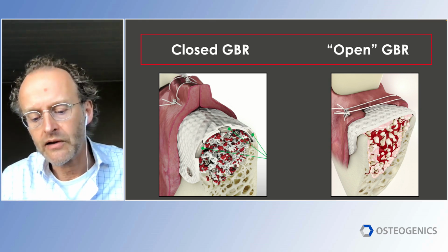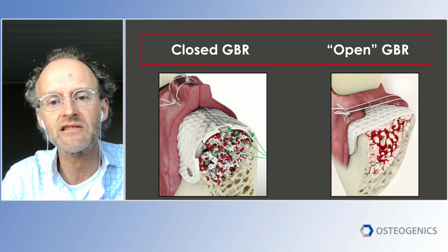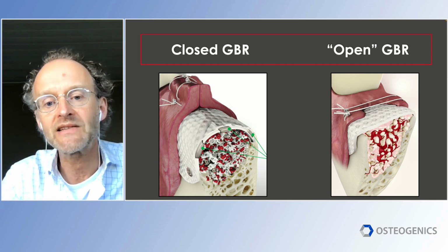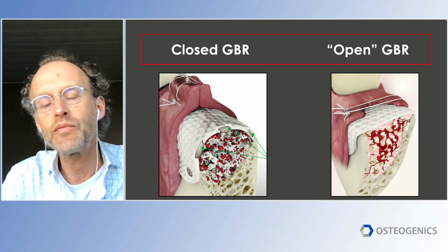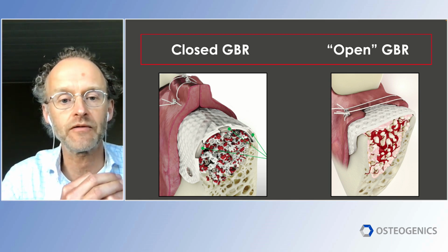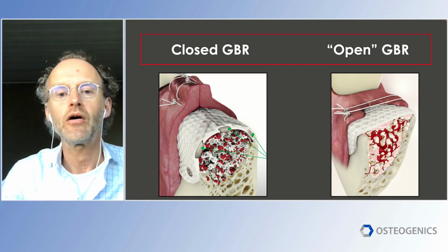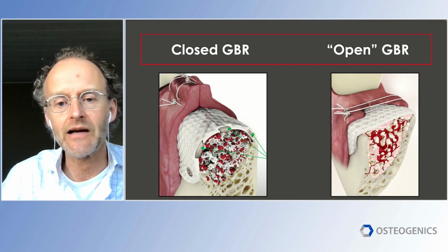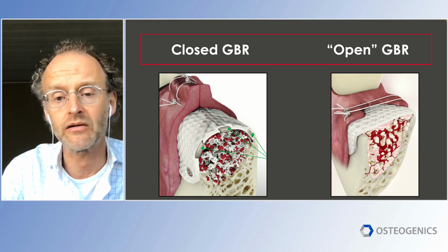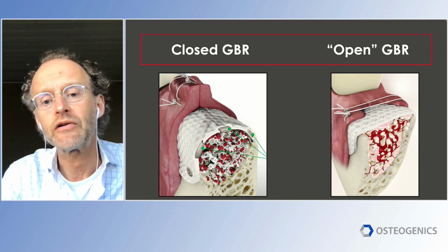But when we give courses, my colleague and myself, or presentations, we start noticing afterwards that participants easily mix up the indications of this membrane. So that's why we started using the term closed GBR on the left screen, and on the right, between quotation marks, open GBR. So meaning that on the left, the closed is the traditional. The tooth is already taken out some time before, and you have to restore the defect. So you apply the membrane, but you close the tissues afterwards. While on the right, with the open GBR, immediately after extraction, you cover the extraction socket with this membrane, and we apply mostly a graft in the socket. So you leave it open. As a kind of stable scaffold, you can place it in.